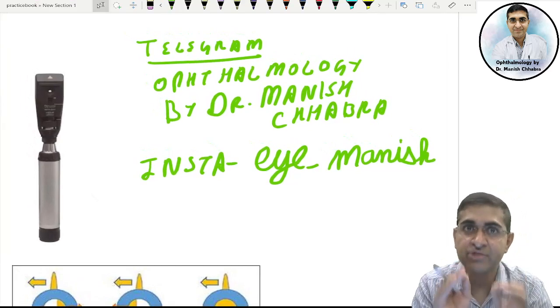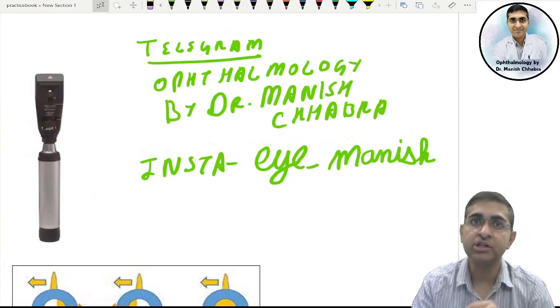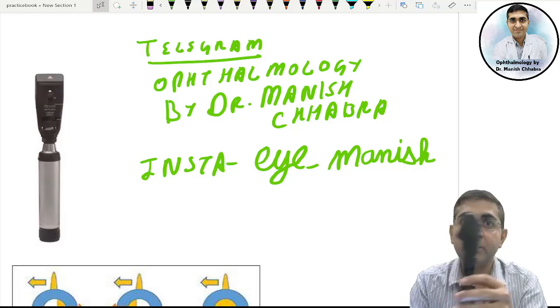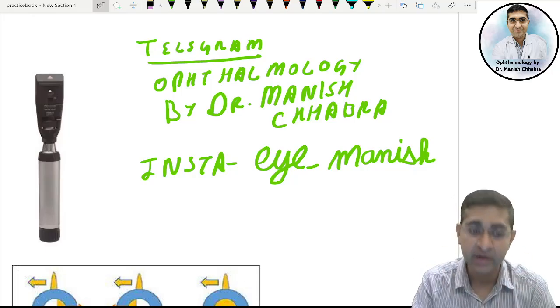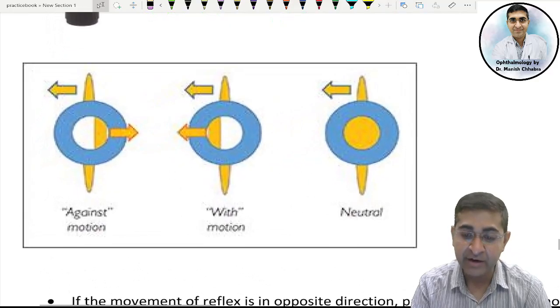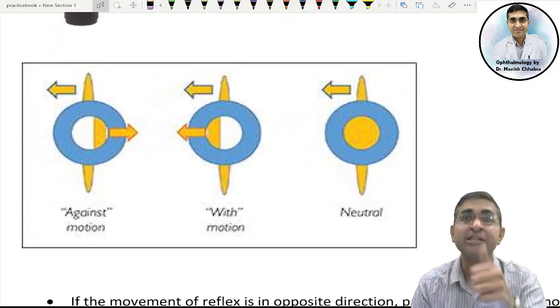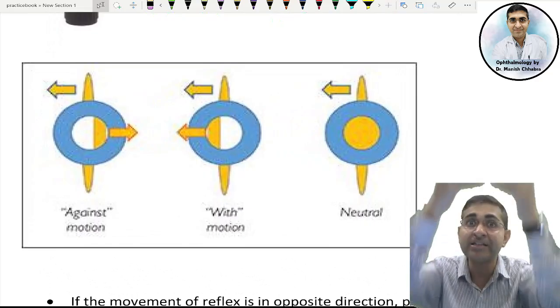Now in this very video, on students' request, I am quickly going to discuss retinoscopy. Retinoscopy is the objective method of verification of refractive error in the patient. Refractive error verification can be done in a subjective way as well. You are already aware of that, that is via Snellen's chart.